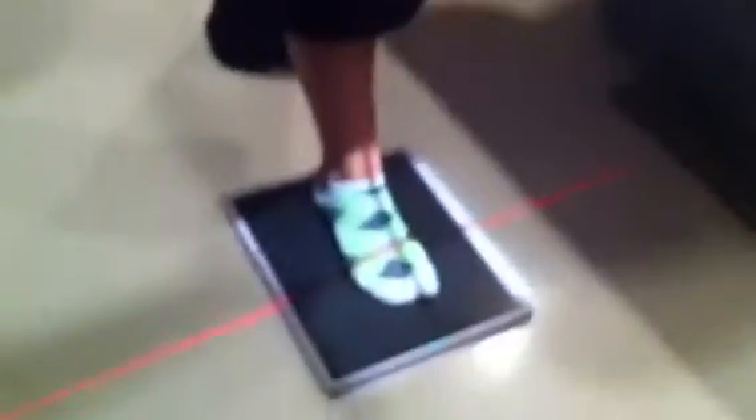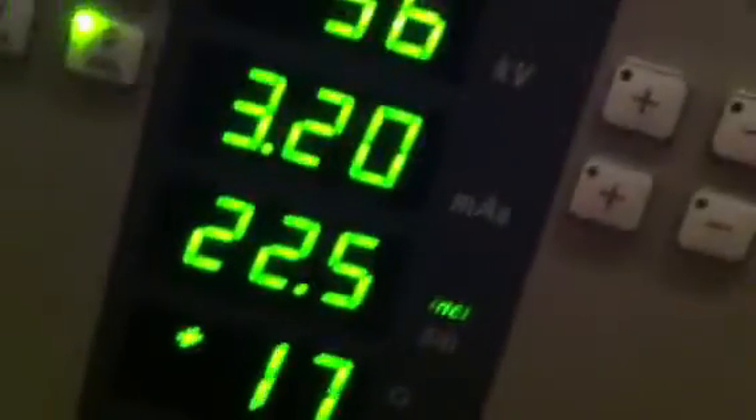For the first picture, the other foot is going to be behind the patient. Is it 40 inches? It is, yes. 40 inches, collimate — don't collimate, you're the foot off in the back. This is the AP composite, AP axial weight-bearing composite.